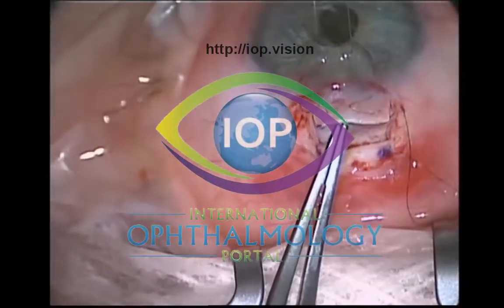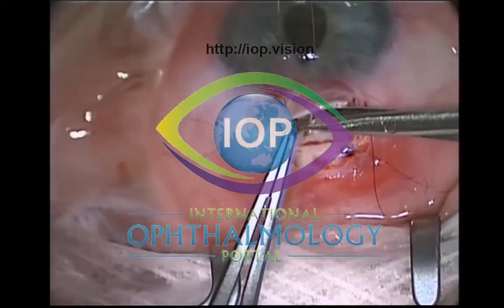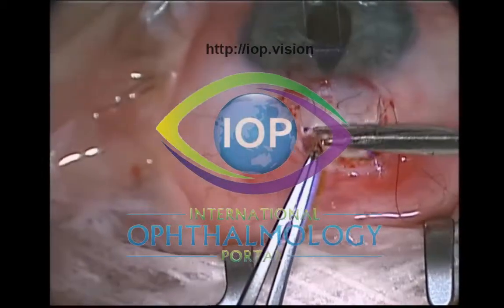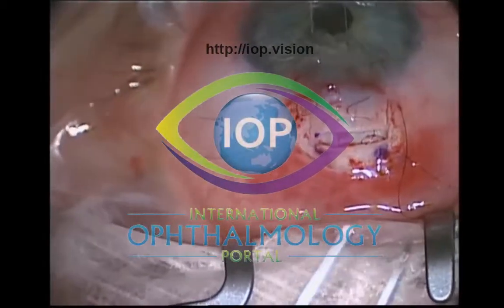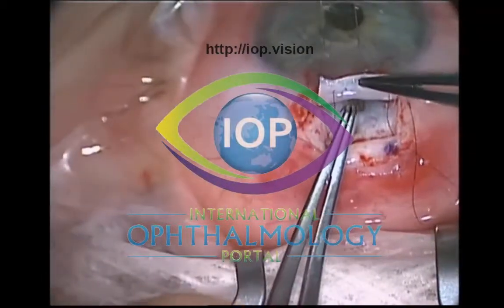If I can avoid doing an iridectomy, I like to avoid it. The argument for iridectomy is to potentially stop the peripheral iris tissue being incarcerated into your sclerostomy. I find that if you cut your sclerostomy and the iris tissue comes up to your sclerostomy, that's my indication for doing a peripheral iridectomy.